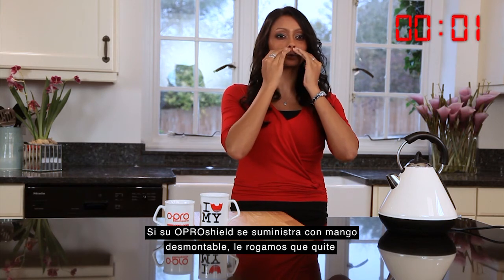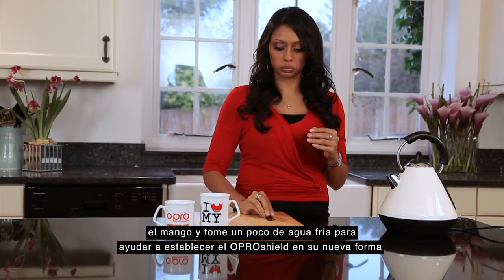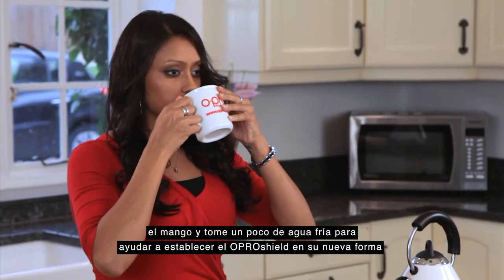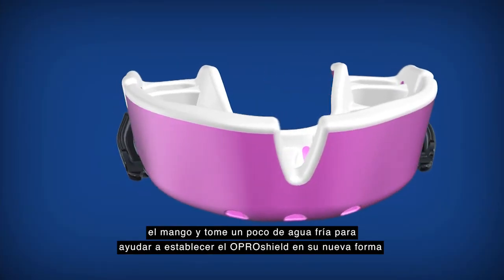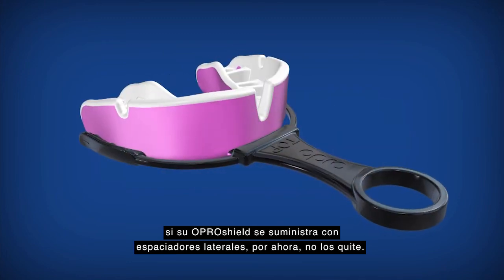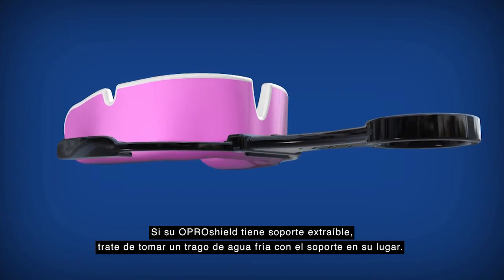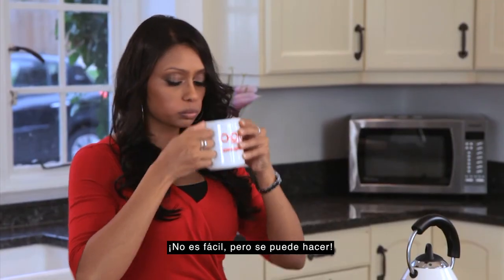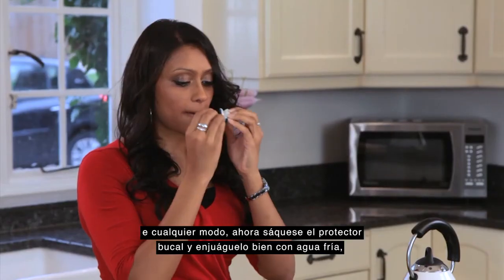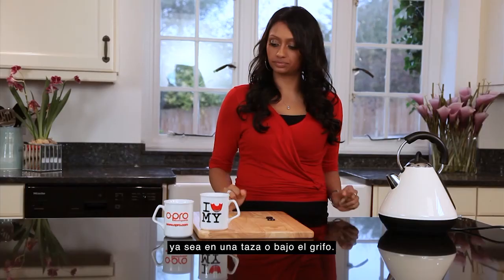If your OproShield has come with a removable handle, remove the handle and take a drink of cold water to help set the OproShield in its new shape. If your OproShield comes with side spaces, leave them in place for now. If your OproShield has come with a removable cradle, try to take a drink of cold water with the cradle in place — not easy, but it can be done. Either way, pop the mouthguard out and rinse it thoroughly in cold water, whether in a cup or under a running tap.